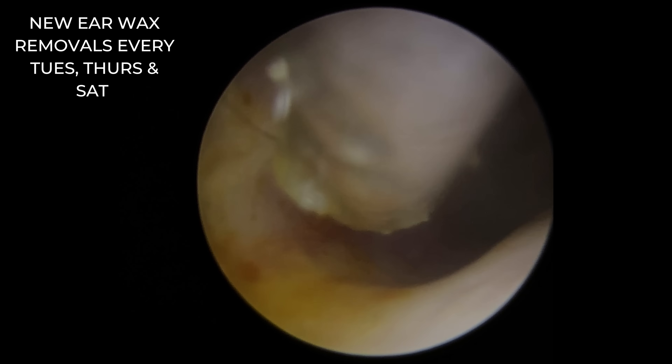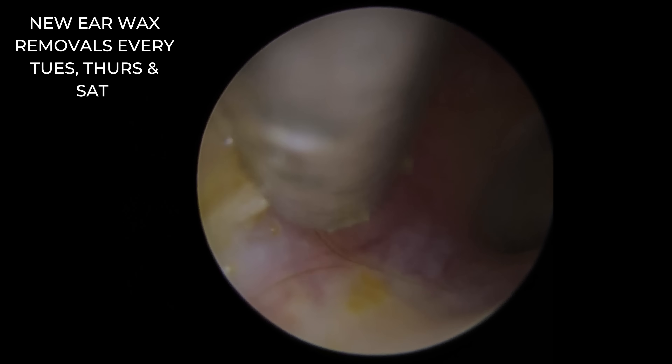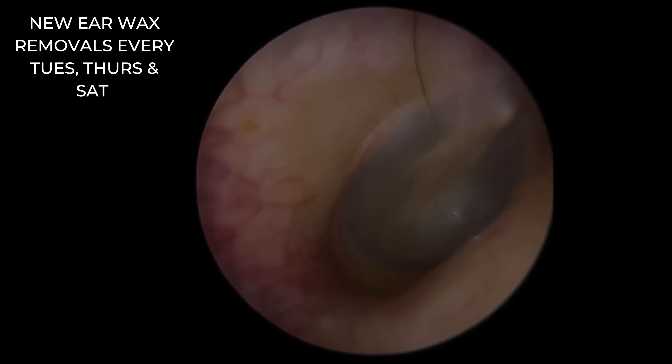There we go. You can see just how much oil — it's literally leaping off the canal wall into the suction. Just getting rid of some of the little bits of dead skin. Now, the blood vessels — you can see — we'll go back to it. There's what it looks like before, there's after.